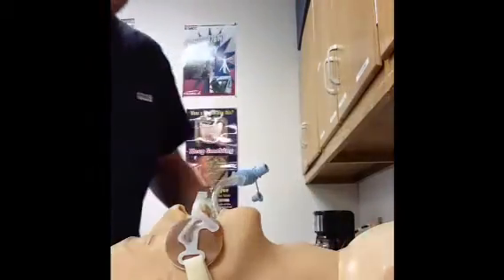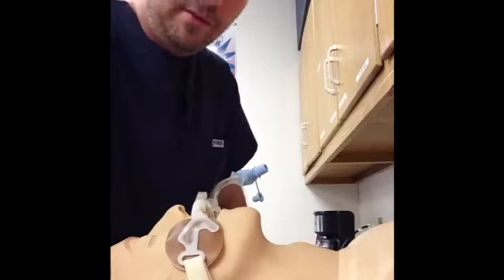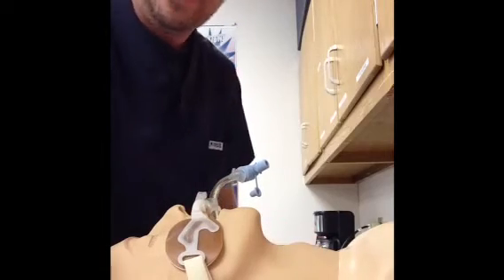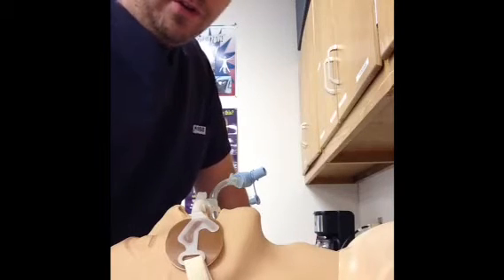After I finish up here, I'll show you a quick view of me actually inserting the bronchoscope. It's really kind of hard to see — the camera had a hard time focusing — but you should be able to see the carina and the right and left main stem bronchi. This is the end of your introduction to bronchoscopy. I hope you enjoyed this and hope it made sense. As always, thanks for hanging in there. Thank you.